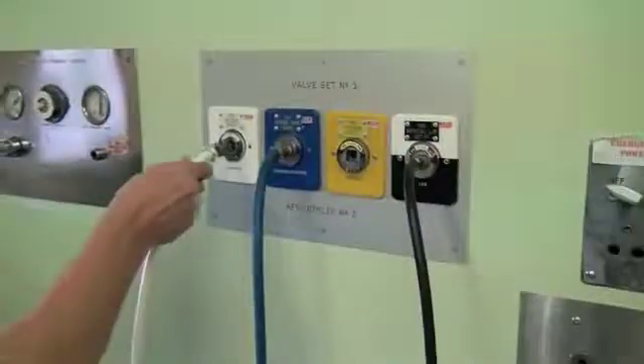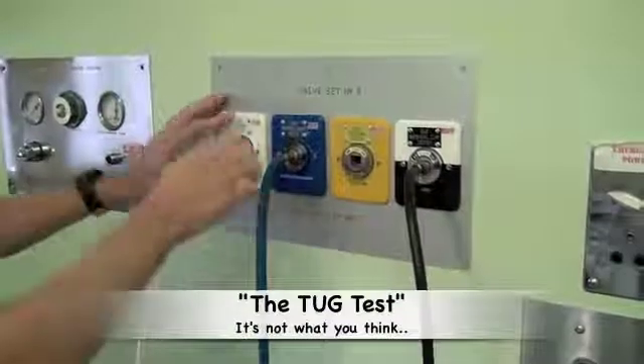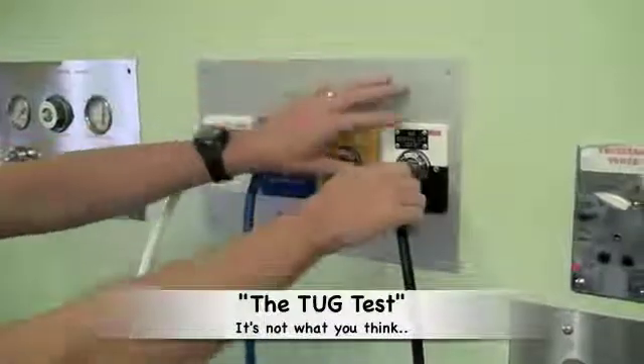Having tested the oxygen failure alarm, one now needs to reconnect the oxygen hose to the wall and perform the tug test. The tug test is performed for each of the medical gases.